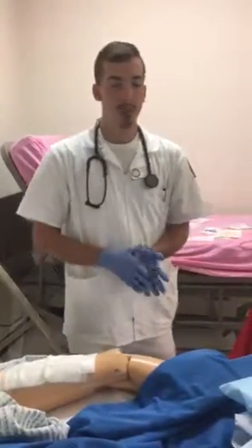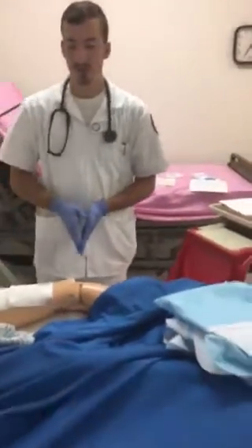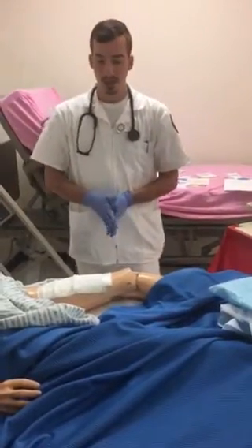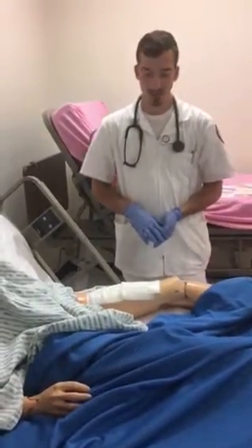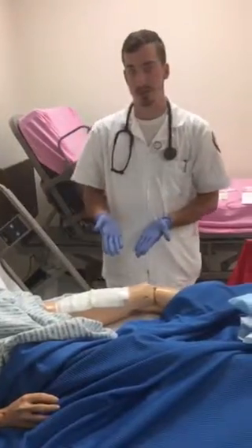Today I'll be demonstrating a sterile dressing change technique, and I've gone ahead and performed hand hygiene and donned my clean gloves. So I'm going to first verify my physician's orders, and I do have an order to perform a sterile dressing change once daily and as needed. So I'm going to second verify my patient ID with two identifiers, name and date of birth, and then at that point I'm ready to start the dressing change.